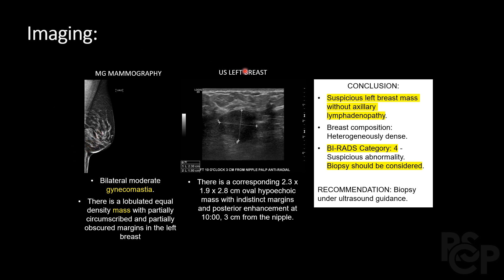Moving over to the left breast ultrasound, there is a corresponding hypoechoic oval mass with indistinct margins but with some posterior enhancement as well.